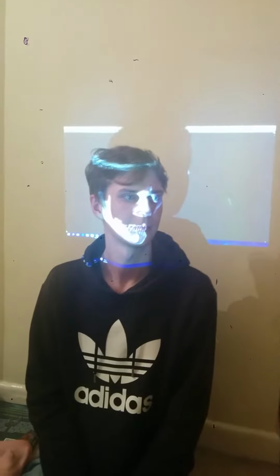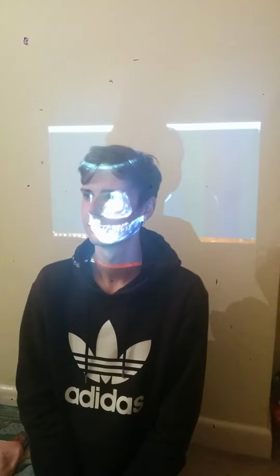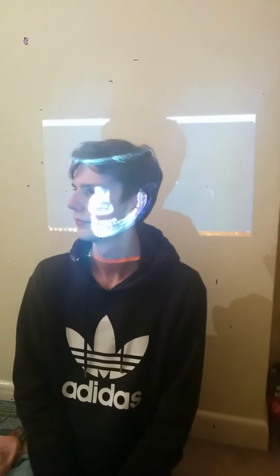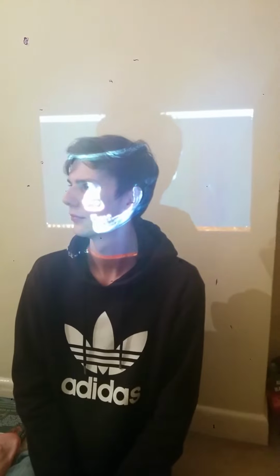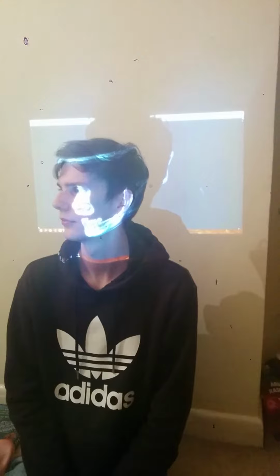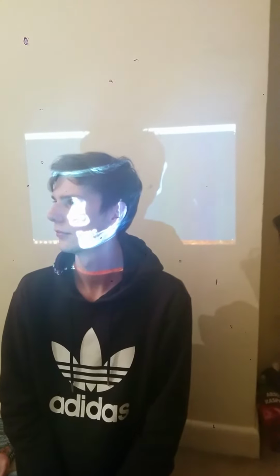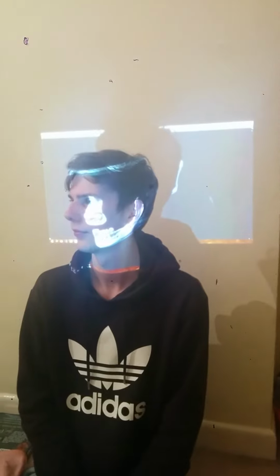As you can see, if the patient now turns his head to the right, you can see the system on his face as it scans, and the speed at which it scans is done by an averaging. If you increase the averaging, then the image moves less jaggedy. However, it does increase the amount of time it takes to respond to patient movements.